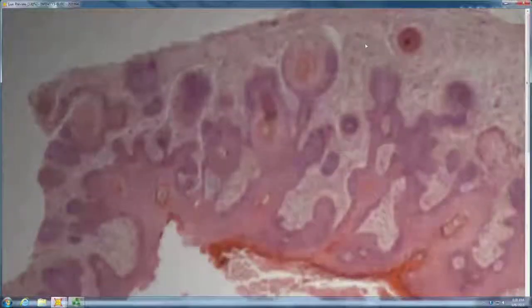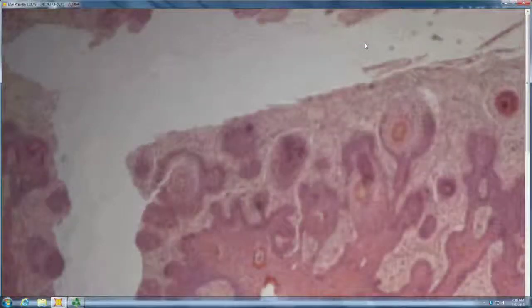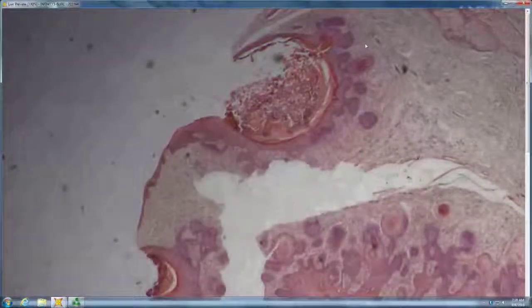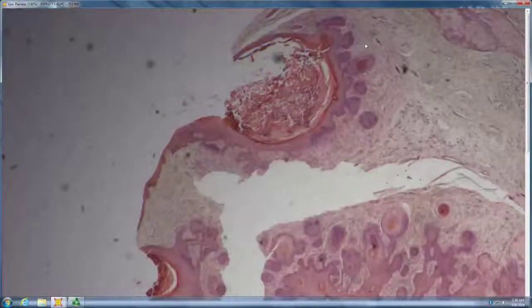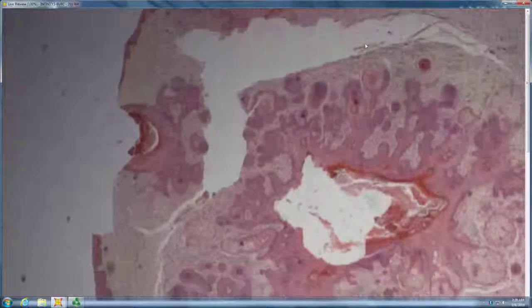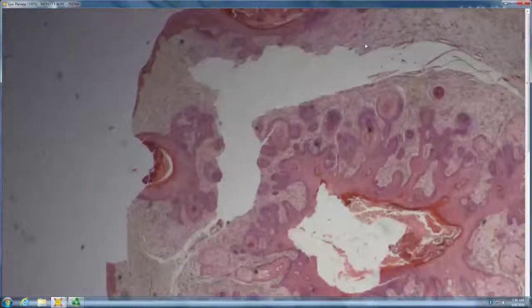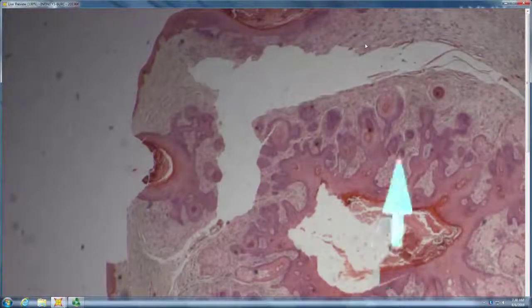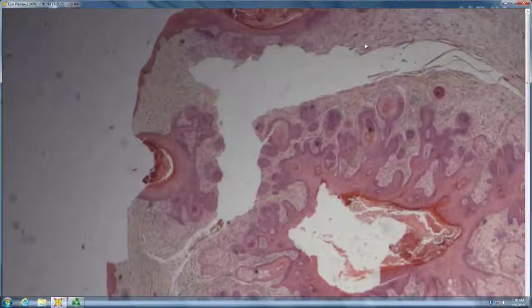Okay. Morning. So, Young, what do you think? It's folliculum. Yeah, trichofolliculoma, because you have a central infundibulum-like space. And radiating from that, you have all the little baby follicles. You have mama follicle and all the little baby follicles radiating off. So trichofolliculoma.